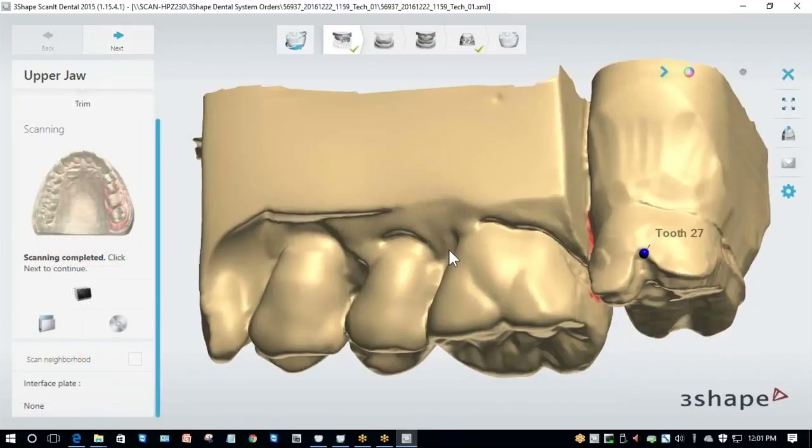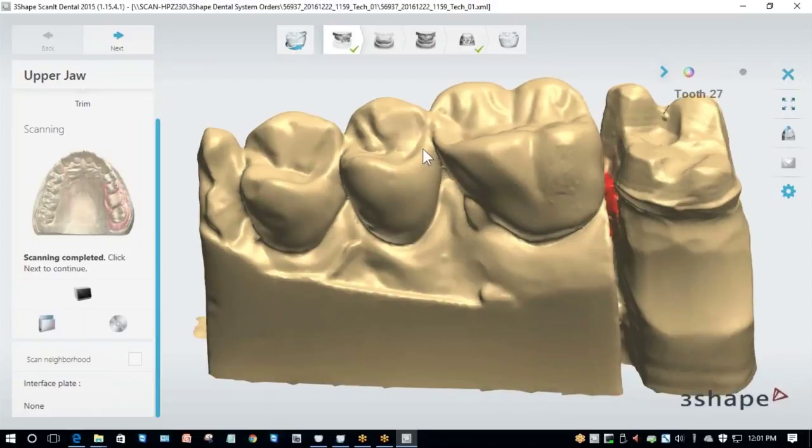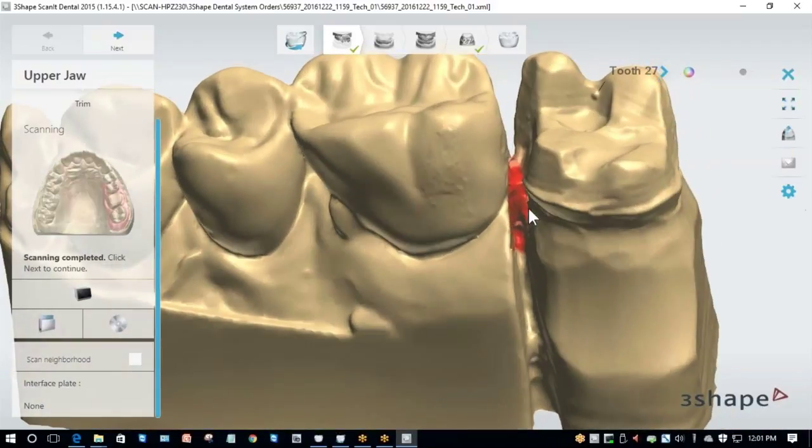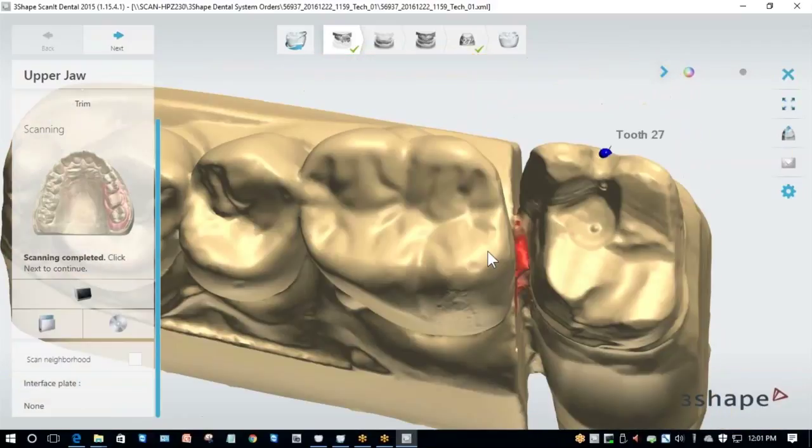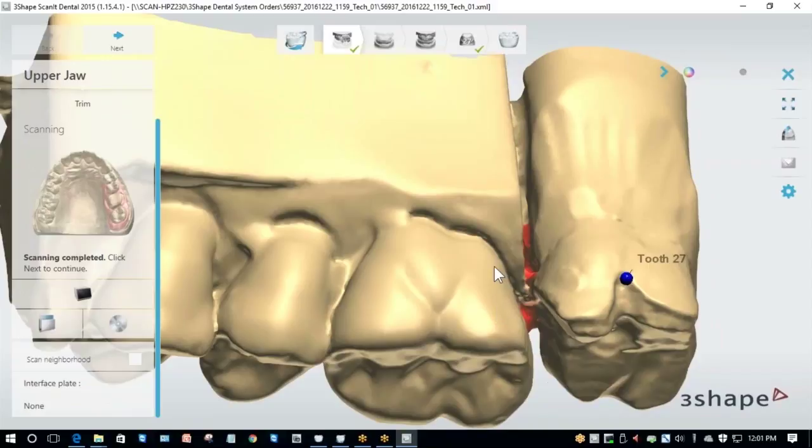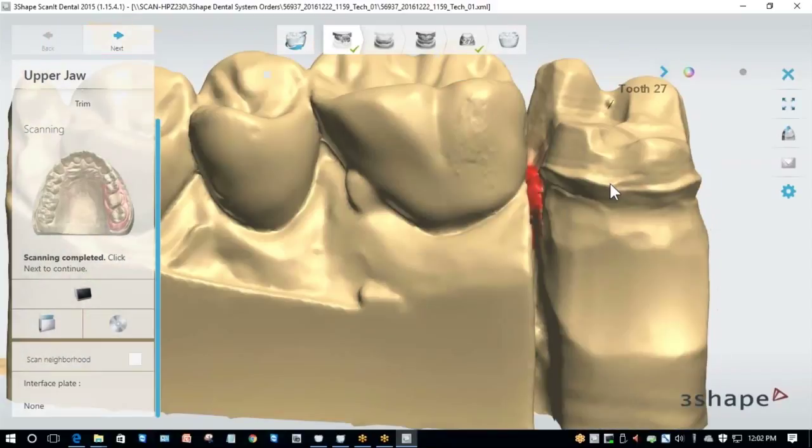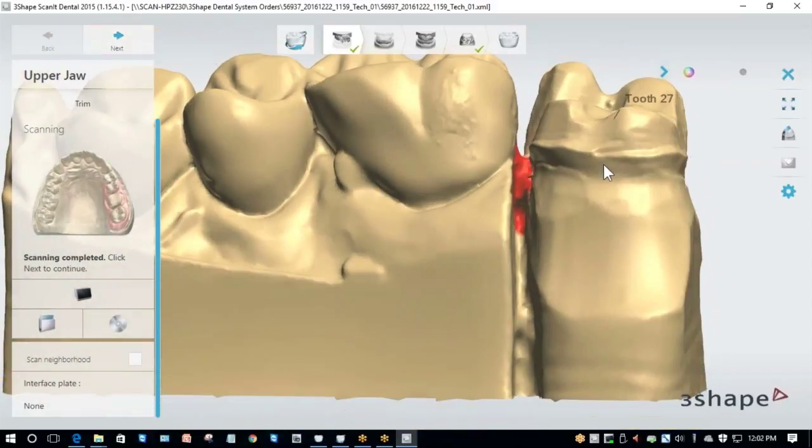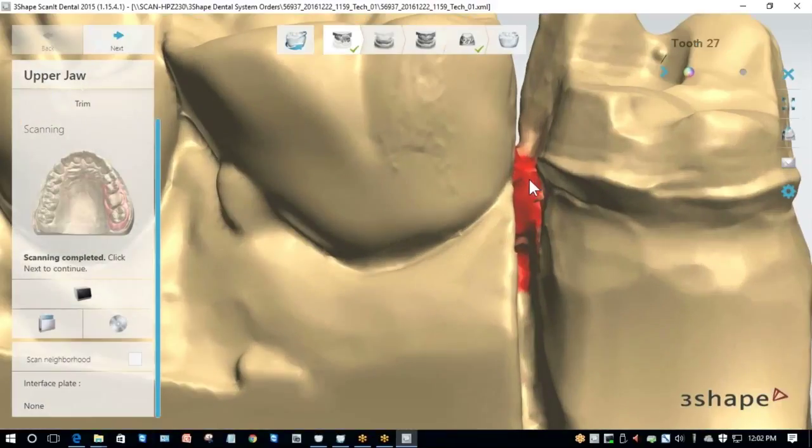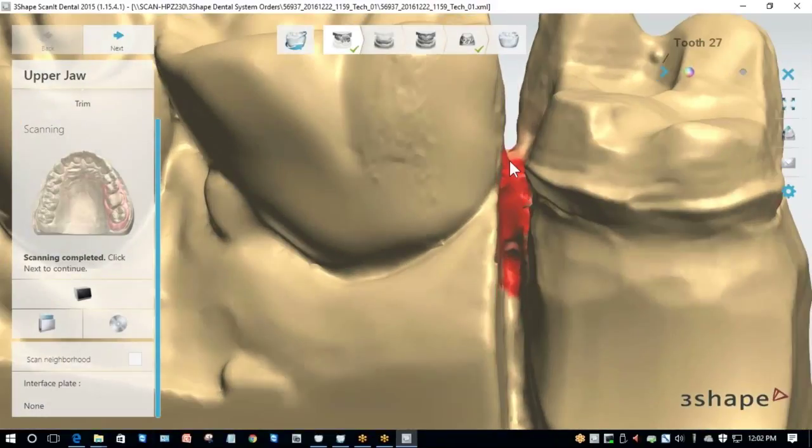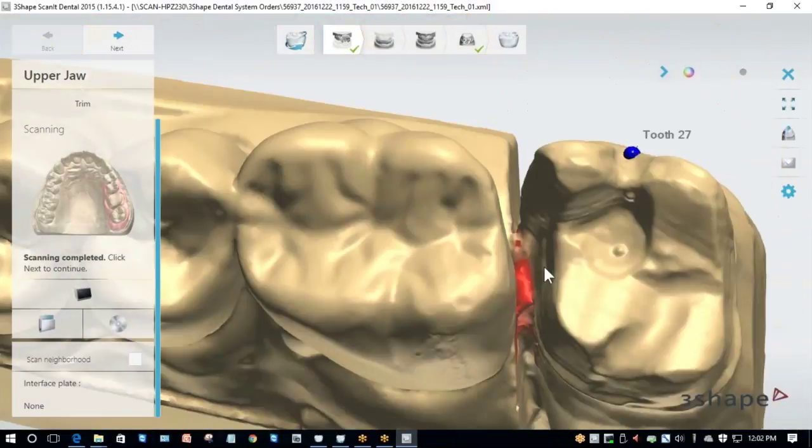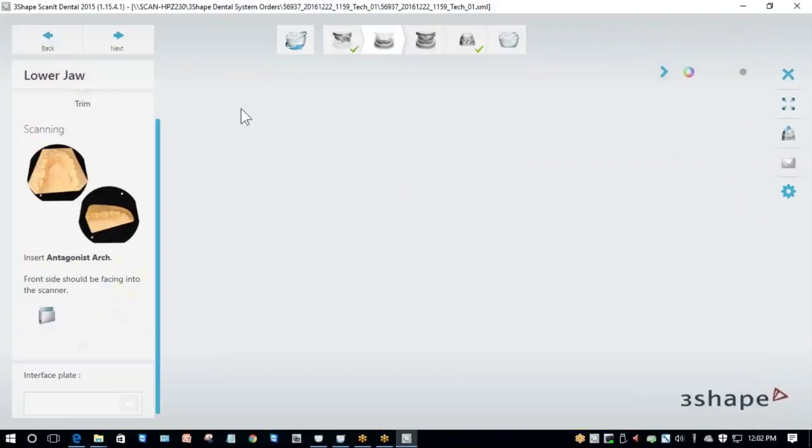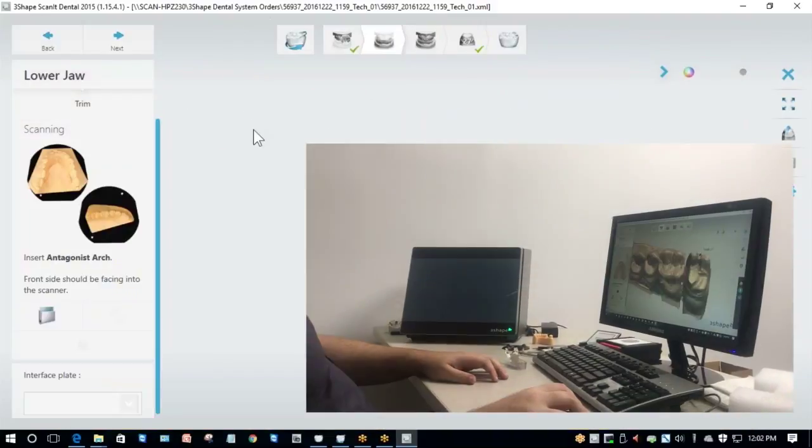Now it's finished scanning my model and I have the final scan here. Very satisfied with the scan. If you see red area down here, it's because some scanners attempt to scan the die in the model and it shows red in the areas it had trouble scanning. I'm not too concerned about this red area because I'm going to be scanning this die separately anyway. So because I'm satisfied with that, I'm going to click Next.